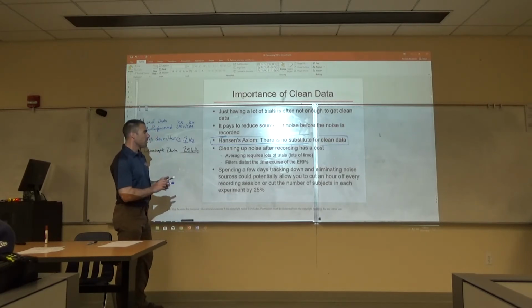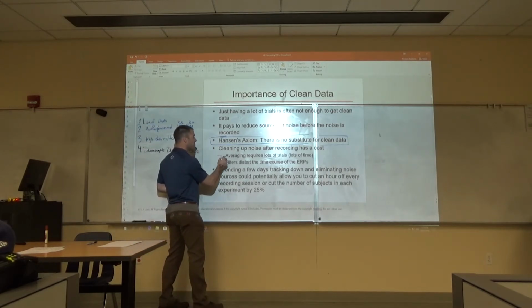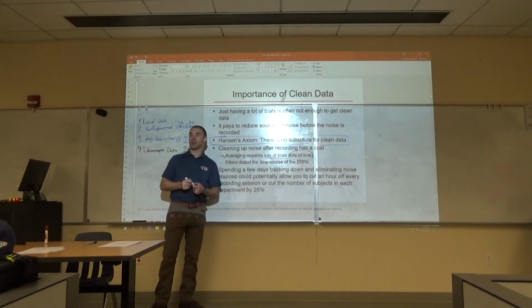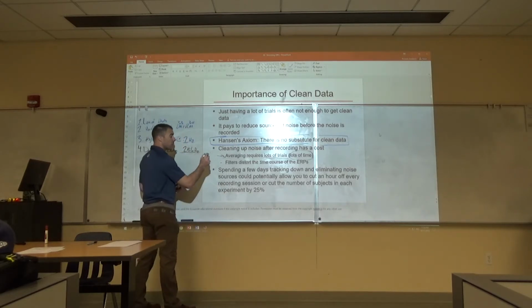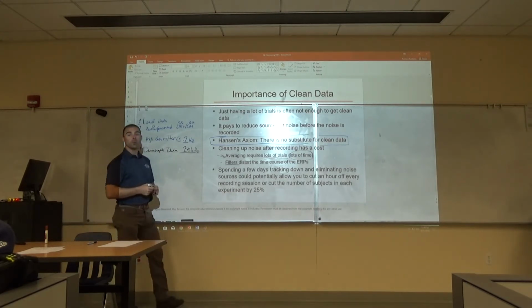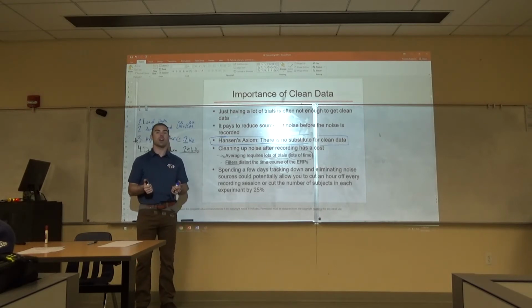Because here are some drawbacks, right? Averaging out that noise takes a lot of trials, and that also takes a lot of time for people to complete those tasks. Now, if we're going to filter, like we did here, we did a high-pass filter. Here's the deal with filters. Every time you do something to change the data, do you know what you do?